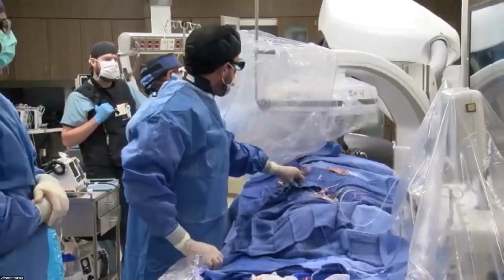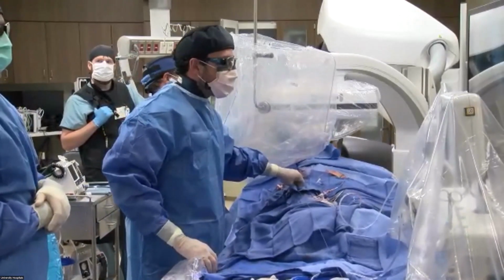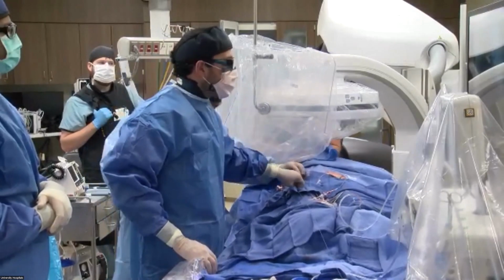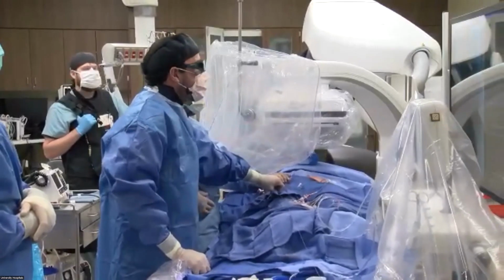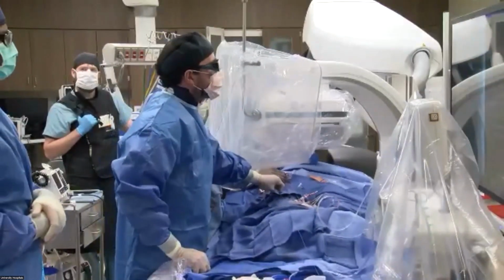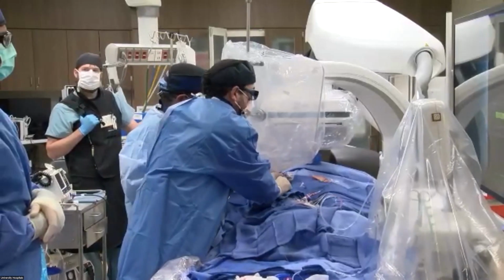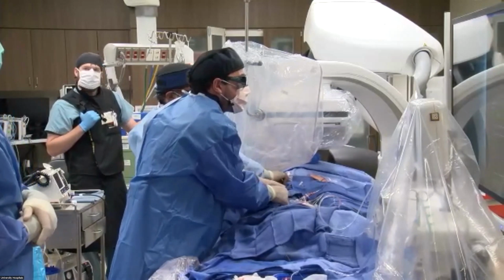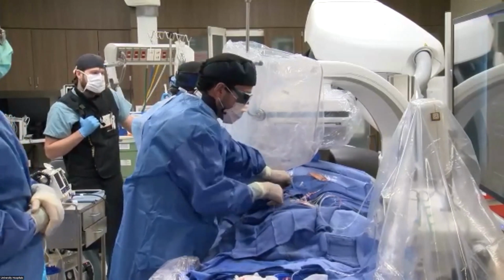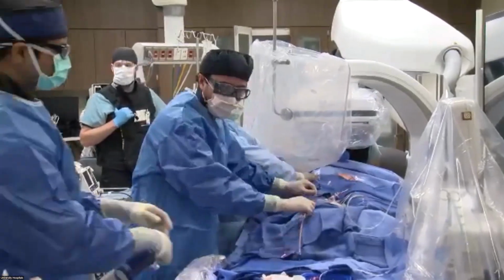All right. Bill, just to keep you on time, you have about 15 minutes. Yeah. So I just want you to focus on the cusp overlap technique so that the audience gets the opportunity to see that. Absolutely. So one thing that is important, thank you for that comment, is that Chris, you have more? Let me take the inline sheath out, the 14 French sheath out. Sorry, you're going to feel pressure now. You're going to feel pressure now, darling. Nitesh, help me, man.